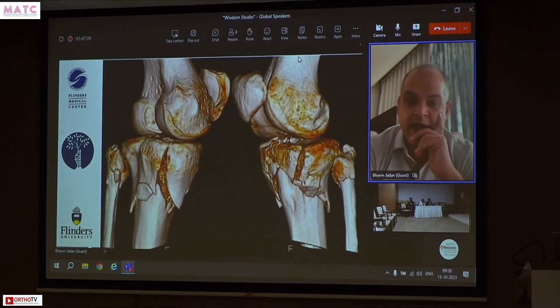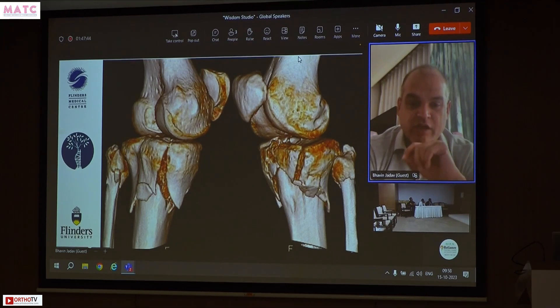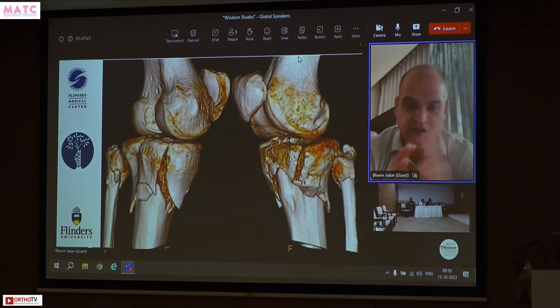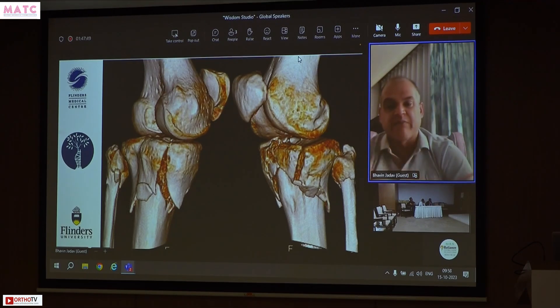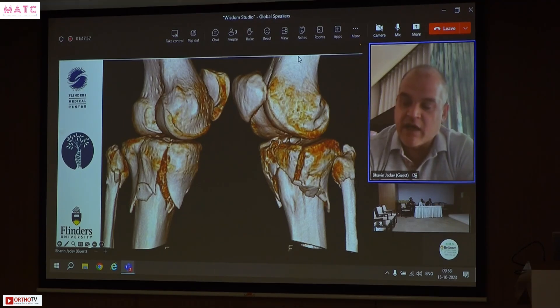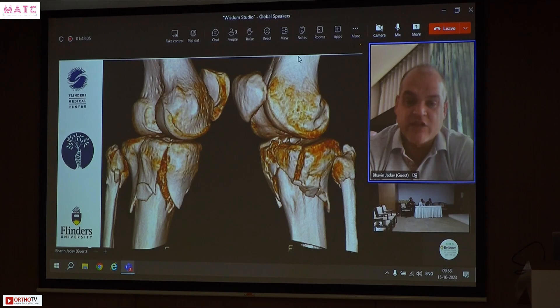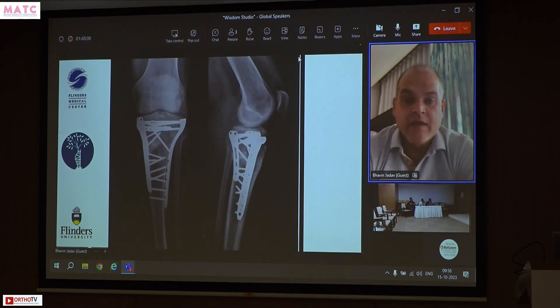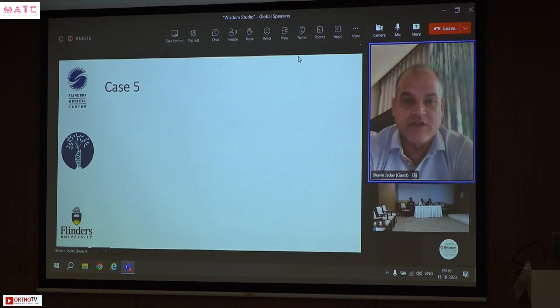It's not always easy to decide whether you need a posteromedial plate or a standard direct medial plate. For example, this medial-sided fracture has a double apex — a posteromedial apex requiring a buttress AND an anteromedial apex. All apexes need buttressing because that's where the loading point of failure will come. This required both a posteromedial plate as well as a direct medial plate, plus a lateral plate for reducing the lateral joint line.